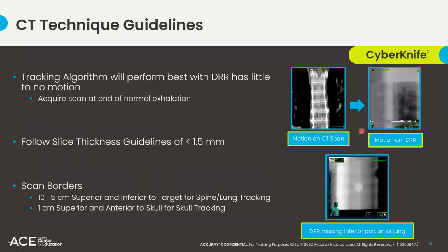Although the bullet points on this slide are unrelated to technique, they are equally important to producing a high quality DRR. The algorithm that determines patient positioning decisions will only perform as designed if the DRR meets certain guidelines. We demand and expect sub-millimeter accuracy from the system. And for that to be possible, our DRR must meet certain criteria.